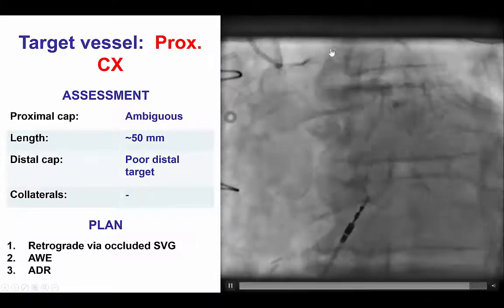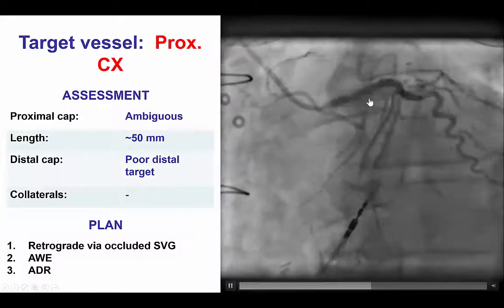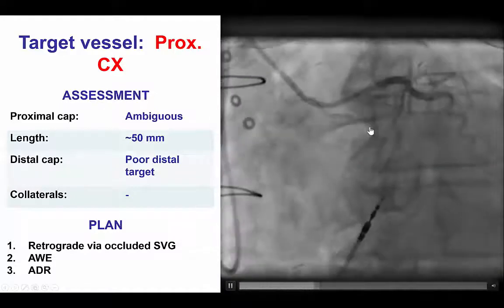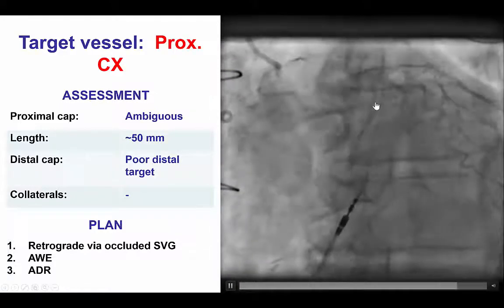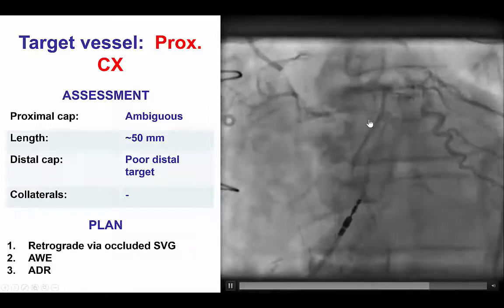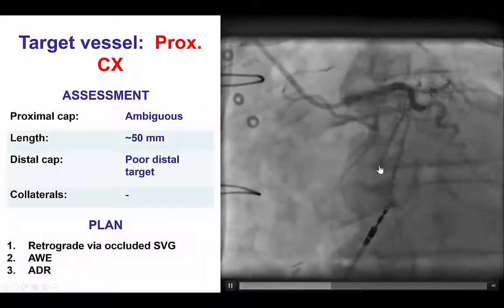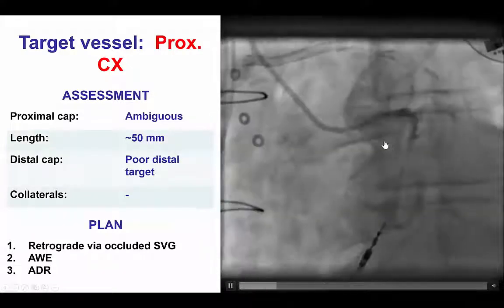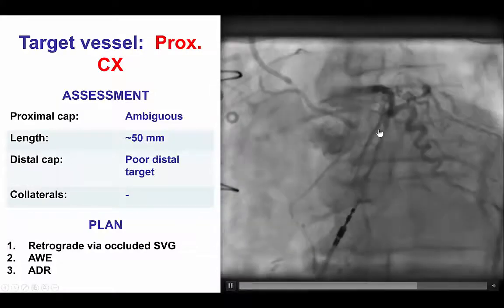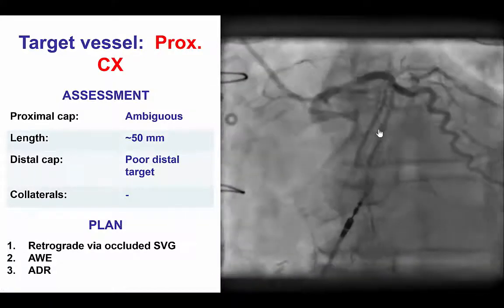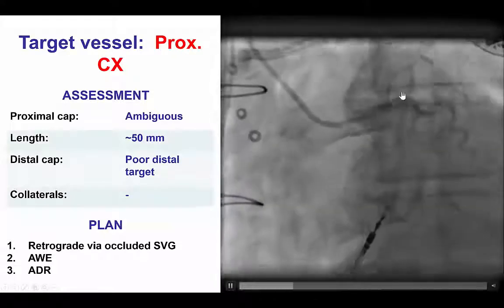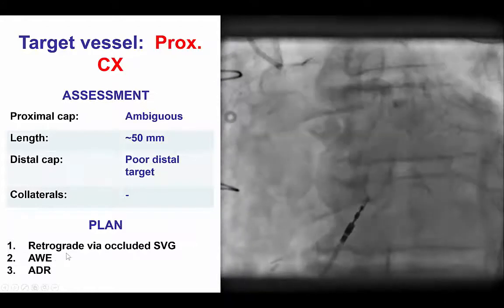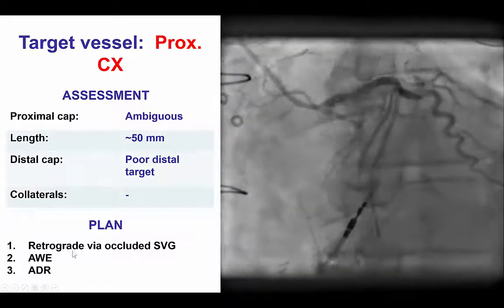Looking at the baseline characteristics, this was a proximal circumflex CTO with an ambiguous proximal cap. There were two marginal branches coming off at the proximal cap, making it very hard to determine where the occlusion was starting. The distal vessel appeared to be diffusely diseased, and the lesion length was estimated at about 50 mm. There was a recently occluded vein graft to OM3 that could be used as a retrograde conduit, which is why the plan was to start with retrograde crossing through the occluded vein graft.